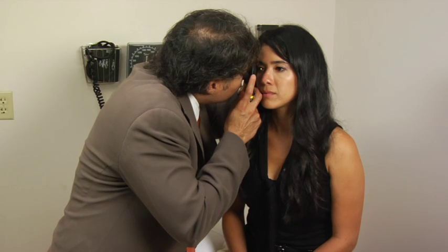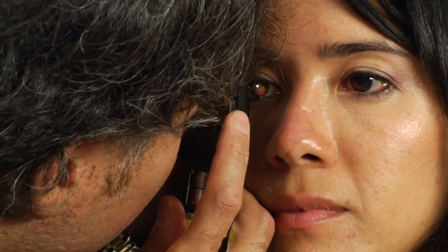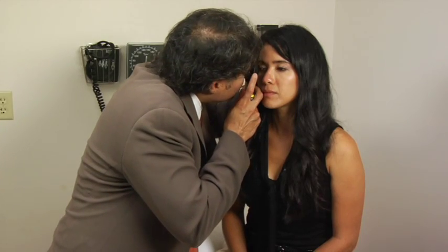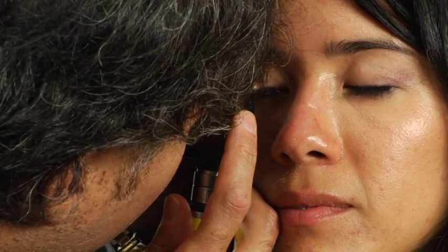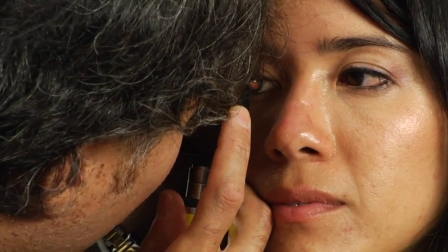Once I've looked at the optic nerve, then I will look at the retinal vessels. And I'm looking at the caliber of the vessels to see if there's any AV nicking, to see if there's any narrowing of the blood vessels, to see if there's any plaques. I'll follow the blood vessels as far periphery as I can go. Once I've looked at all the retinal vessels, then I'll ask Dr. Zhao to look right at my light. And at that point, I'll be looking right at the macula, and I'm looking to see if I see any drusen, hemorrhages, or any other abnormalities.